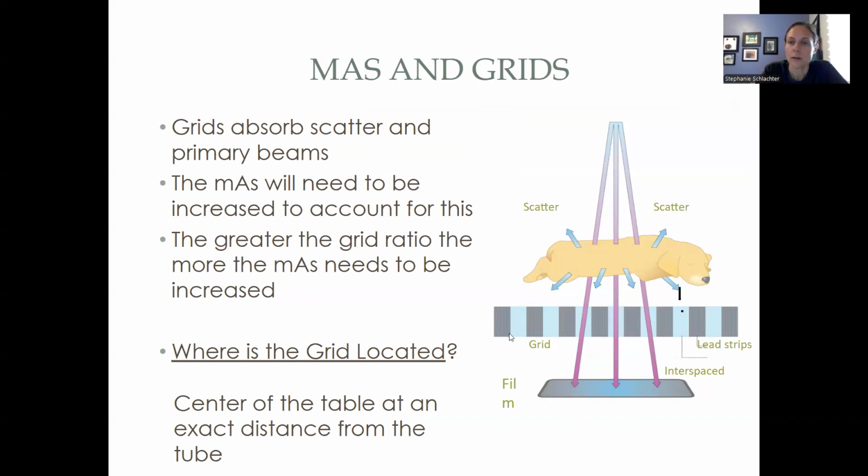And like I said, that grid, it's in that tabletop and it's usually centered. It's usually not the entire tabletop, which is why we want to try and get our patient centered on the table as much as possible. So don't try and take radiographs right down in the left-hand corner. Try and get whatever you're radiographing in the center of that table as much as possible, okay?